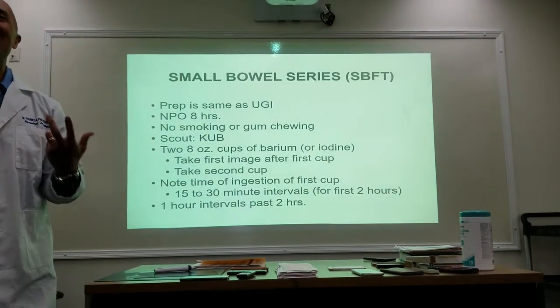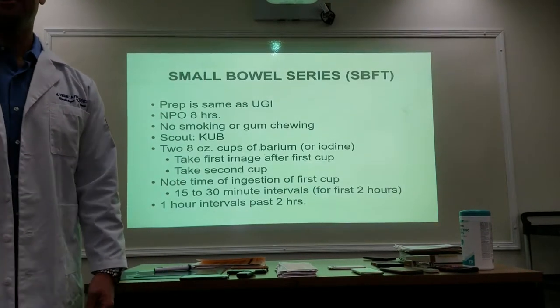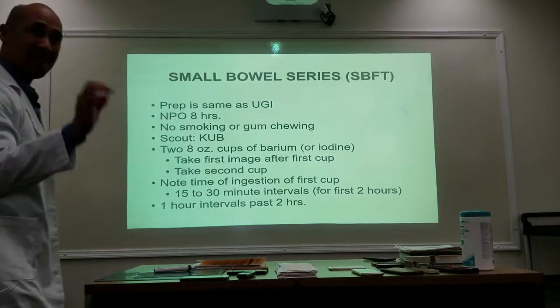Okay, so if the patient can't stand up, RPO them, and tilt the table up. Okay? All right. Does that make sense, guys?